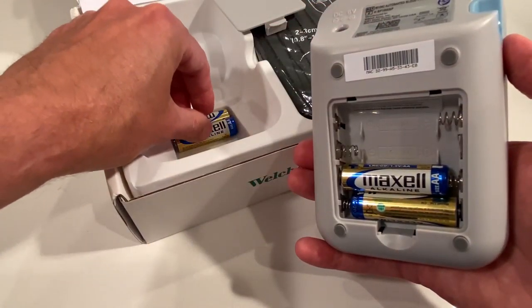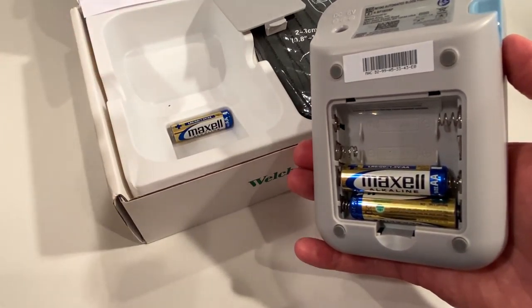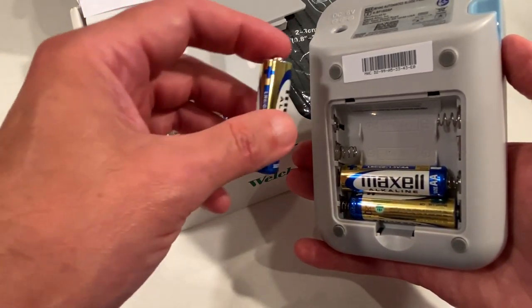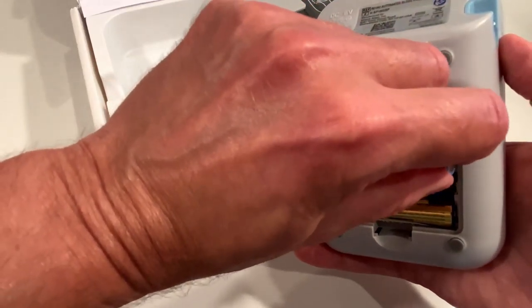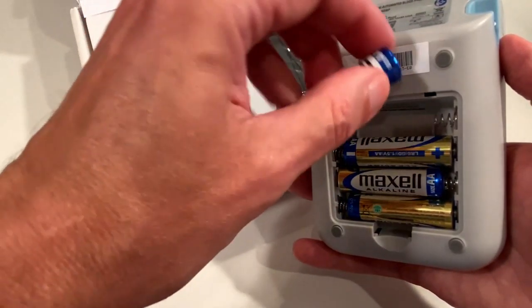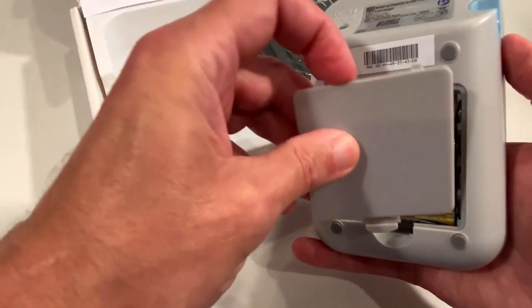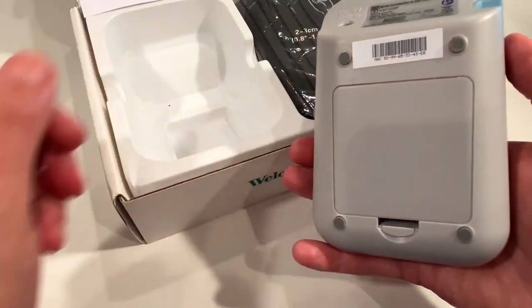It's probably the only con I have about this monitor — I wish they included the wall outlet adapter, but most monitors don't include it and it's not needed to use it. It's nice to have if your batteries are drained and you don't have any new ones at the moment and you want to take your blood pressure.